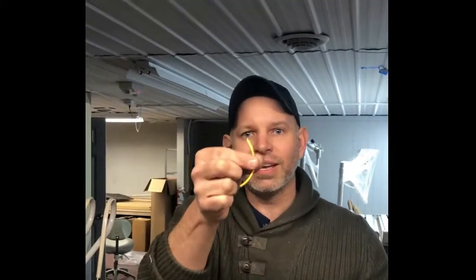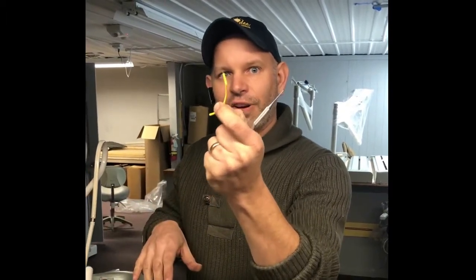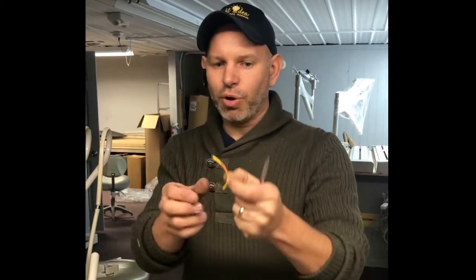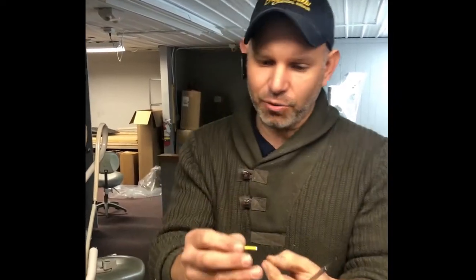This was something that I fought with and beat my head against, and on the first shot on a created problem, we pulled it out the very first try with this piece of tubing. Guys, if you ever have this problem happen and it's broken in the way where you have that narrow part still on the piece that's in there, this can work for you.